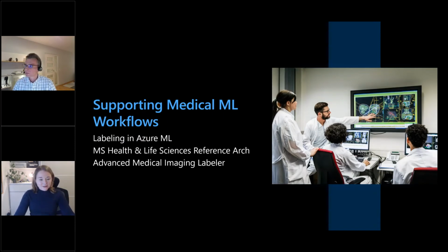Now we will move over to the next section of this session, which is about supporting medical machine learning workflows. I will first give an introduction of the tools that we have available out of the box in Azure Machine Learning, specifically from the labeling side. And after that, I will hand it over to my colleague Ivan to share a bit more on the advanced scenarios, on what goes beyond Azure ML and what is available from there.